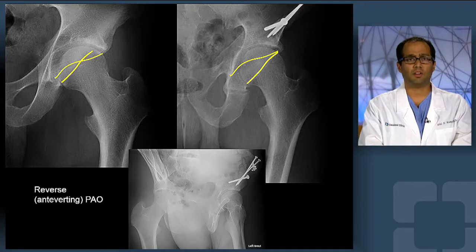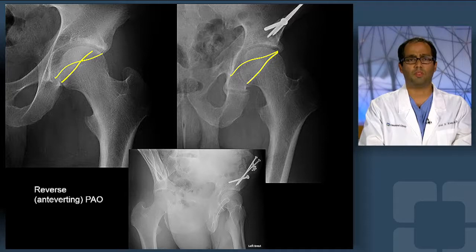As we see here in the preoperative film where the crossover is demonstrated, in the latest postoperative imaging there has been elimination of that crossover sign and fixation through the periacetabular osteotomy. This offers a powerful method for treating the impingement within the hip and also affording more normal biomechanics given the antiverted socket at this time.